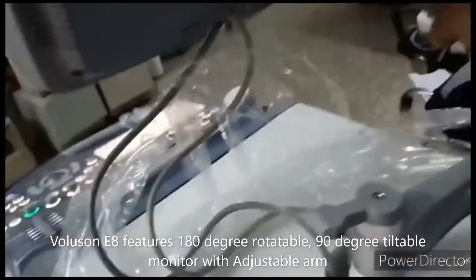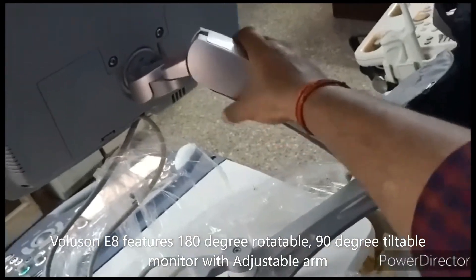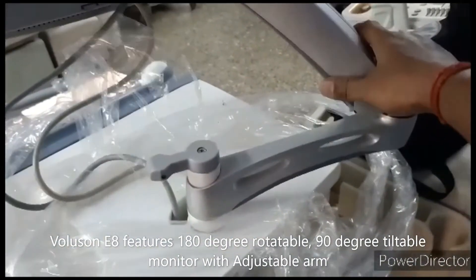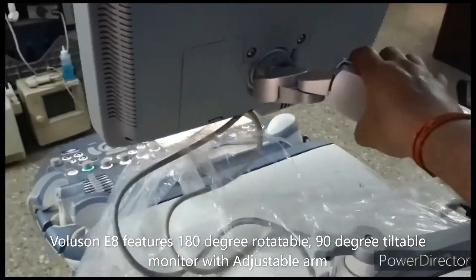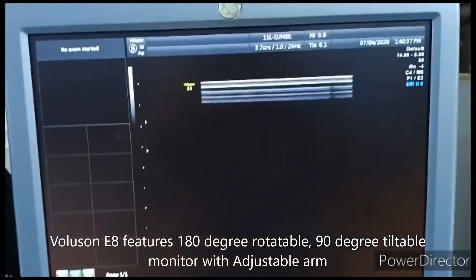The arm can also be adjusted up and down — about 45 degrees — you can adjust it up and down. It also rotates. And you can see here in the scan area.